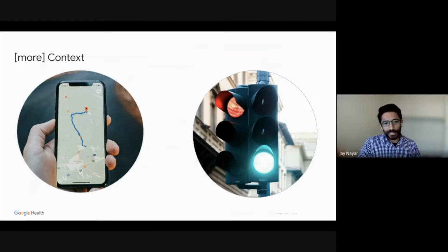Like a traffic light, regulatory surveillance data means specific things, such as clinical studies, 522 surveillance requirements, adverse event reporting, etc. These are requirements that must be followed. But like traffic predictions on your navigation app, AI monitoring systems can provide us with rich data sets from the real-world use case that are useful to gauge the performance of the AI.